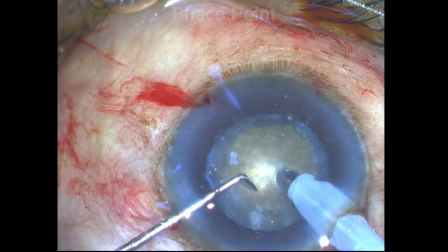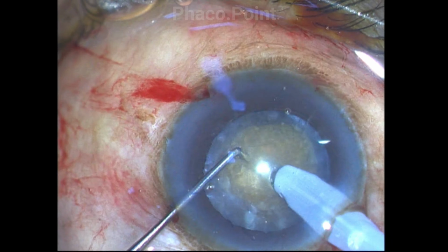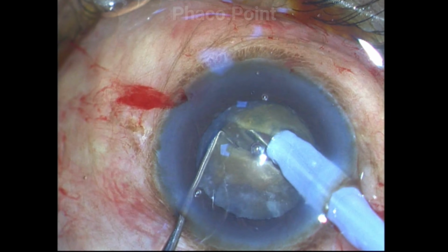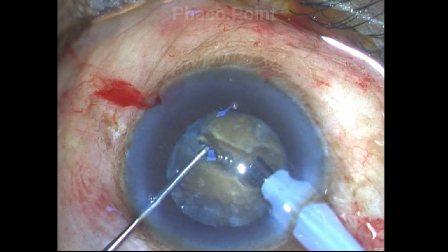So the surgeon now impales deep into the absolute depth to confirm fixity into the nucleus, after which the chopper is introduced. Both instruments are moved apart and the surgeon takes the time to confirm that the fracture crack goes all the way, including the posterior plate.